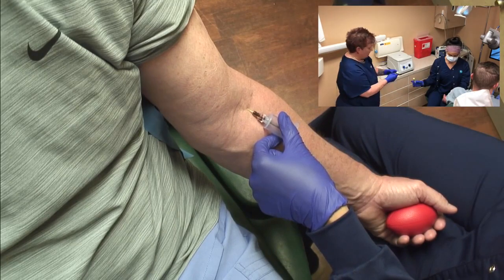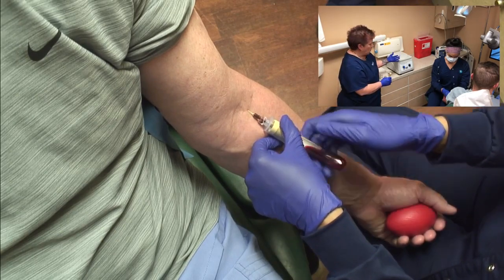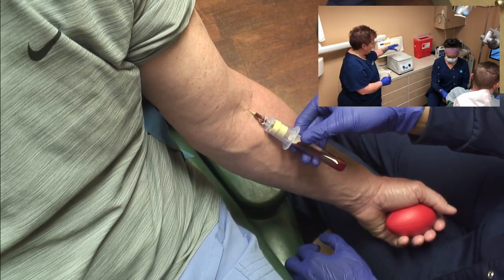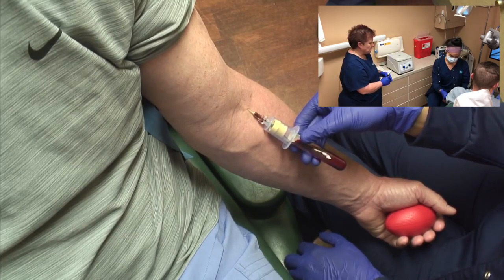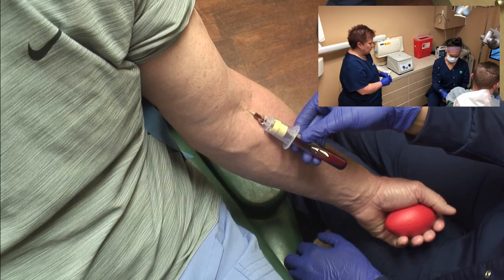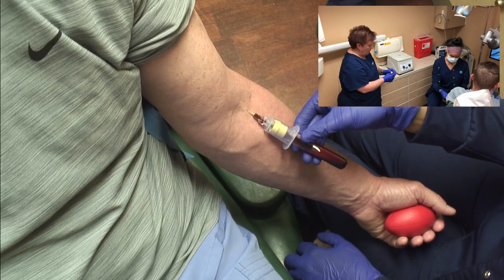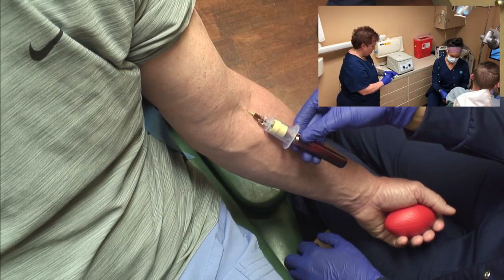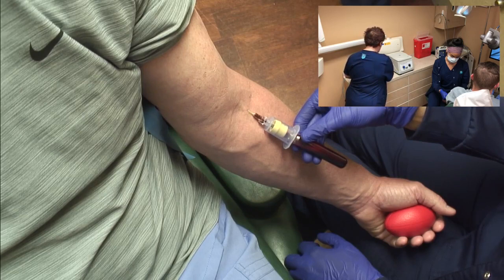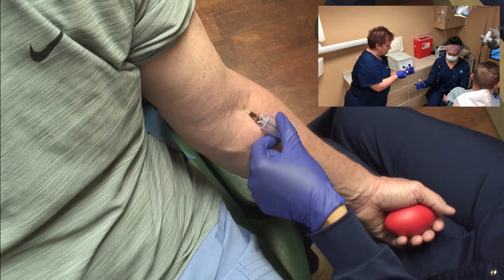And that's filled, and then I'm going to pass her the other yellow tube. Now we have to have these balanced, so I'm not going to open this up yet to put these in. We need to get these in as soon as possible so we get our best PRF. Now I'm going to get our Band-Aid ready while I'm waiting for that to fill. And we twist these a couple of times just to make sure everything mixes up well.